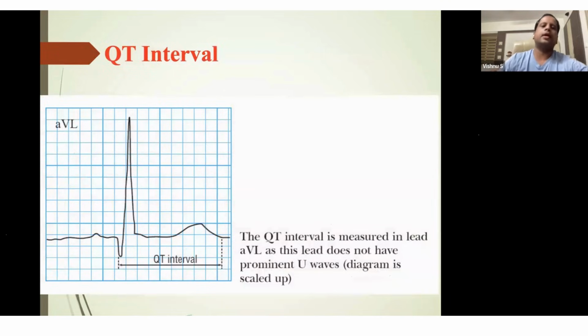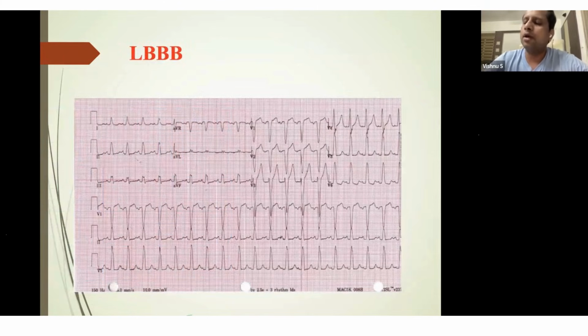So in this clinical context, if you see a new onset LBB, previously it was thought that a new onset LBB was usually pathological and indicated acute myocardial infarction. But nowadays, new onset LBB is not considered as acute myocardial infarction. Usually, it's rate-related LBB that happens in most patients. When the patient's heart rate is around 50, if suddenly with exertion or some anxiety episode his heart rate goes above 100, the patient can develop rate-related left bundle branch block.